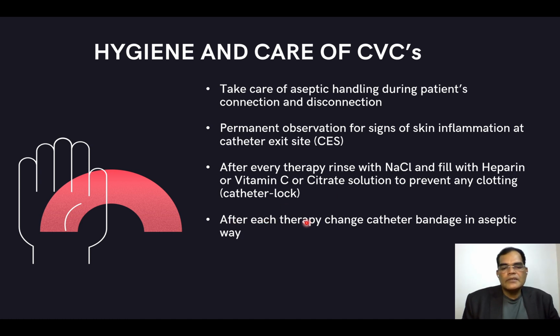One more practice, probably a good practice, is to examine the catheter exit-site bandage or dressing before the commencement of dialysis rather than after the termination of dialysis. So it's recommended to do it before the dialysis so that if there is anything alarming, we can handle it well in advance. Otherwise, the patient will be in a hurry to go home after dialysis. So this will be a little challenging.